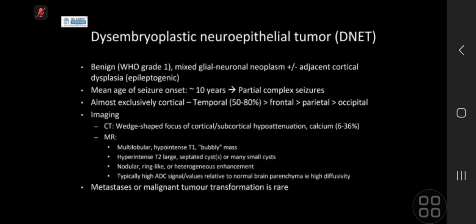You cannot remember all of these for the exams, and remember this is just pediatrics. You also have the other specialties to think about. And pediatric neuroradiology is a subspecialty, which is why I've just chosen key learning points that I want to highlight. So anyway, this is a DNET. It is one of the things that they can show you. It causes epilepsy. I can't pronounce the word today.